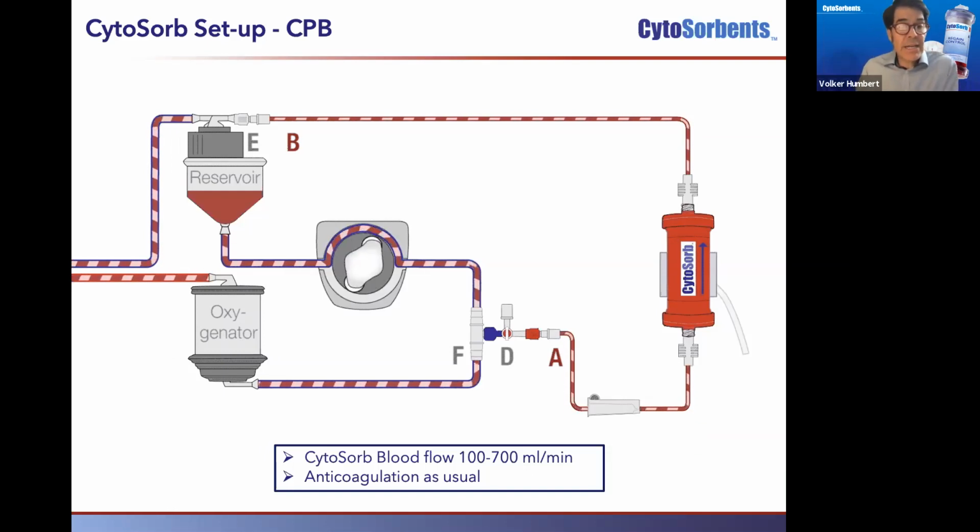The anticoagulation does not have to be altered just because Cytosorb is additionally part of this cardiopulmonary bypass. So you can keep the same levels you normally target when running a cardiopulmonary bypass by itself.